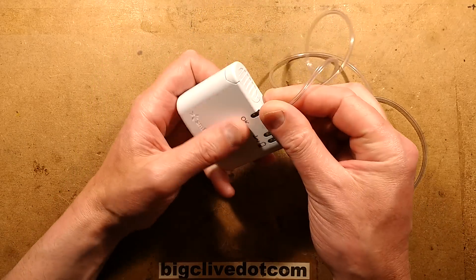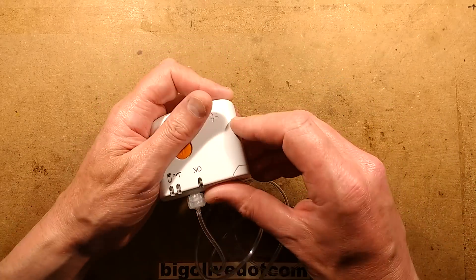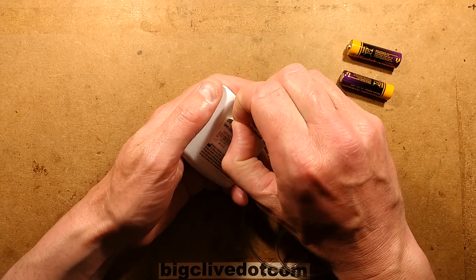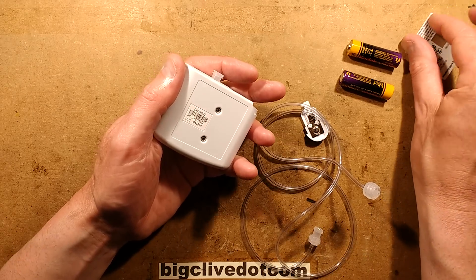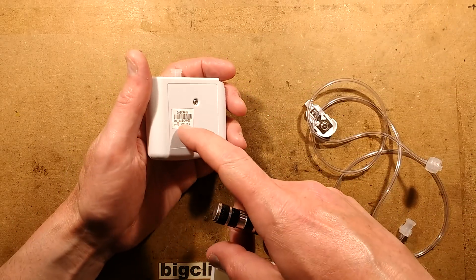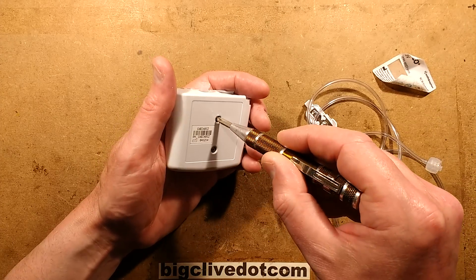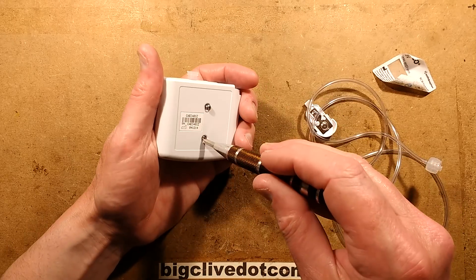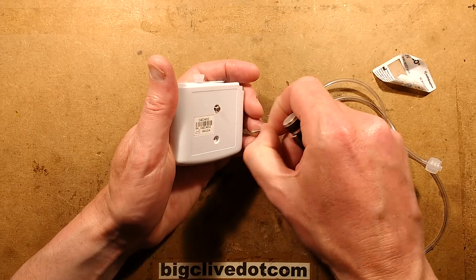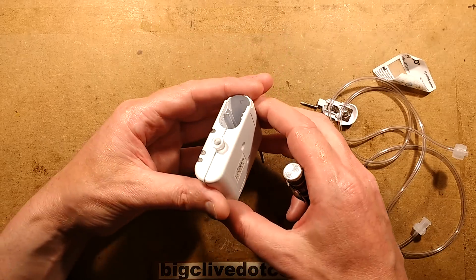They say it saves cost in terms of reduced readmissions with infected wounds, which sounds like a good thing. Looking at the back, it seems the label has been peeled off - I think Magnus did that, probably thinking the same as me: let's see if it can be reset. If you peel the label off it exposes two screws in the back. Interestingly, there's a window in the label that matches up with the serial number - a small printed serial number for the unit with a general label over the top.